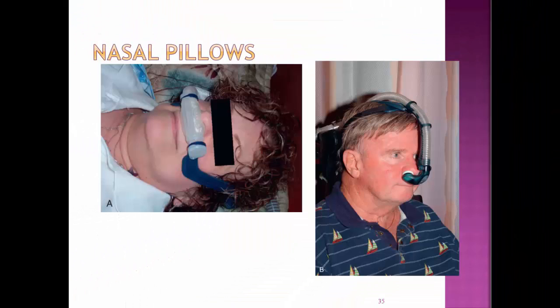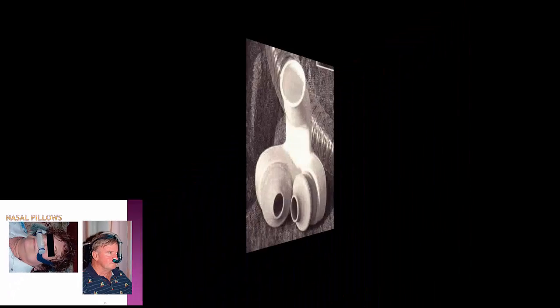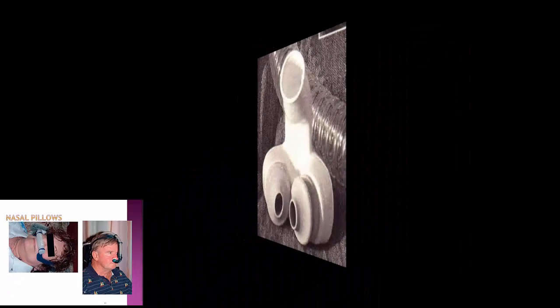Some examples of nasal pillows, a number of different varieties of this option. Again, nothing across the bridge of the nose. In visiting with some of the people that utilize these nasal pillows, most everyone seems to prefer them over a mask.